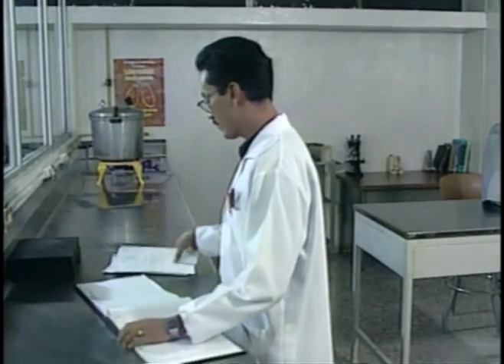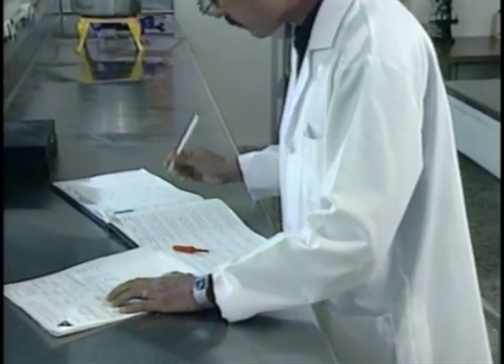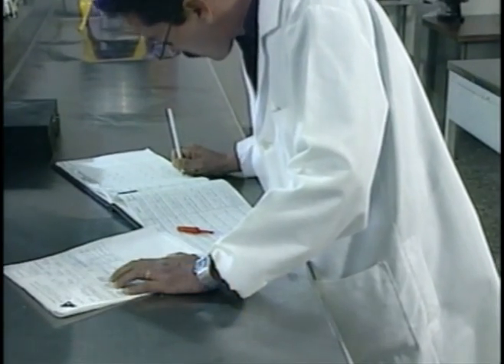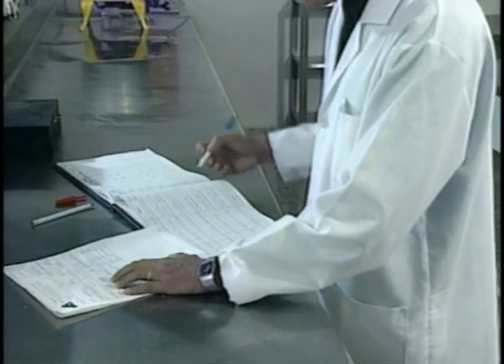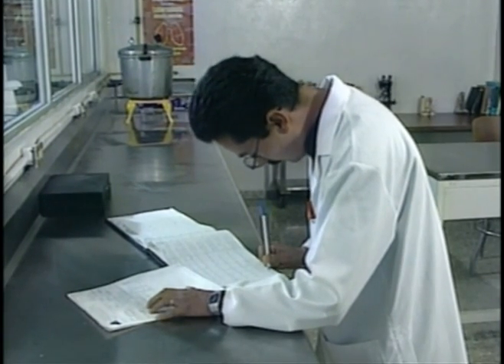It is vital that results of all sputum exams performed be entered correctly into the tuberculosis laboratory register. Enter positive results in red for quick reference. If acid-fast bacilli are seen, report the observation as smear positive for AFB. These patients are infectious and must be registered for treatment with an effective regimen. Testing and reporting should be done as soon as possible, preferably within 24 hours.